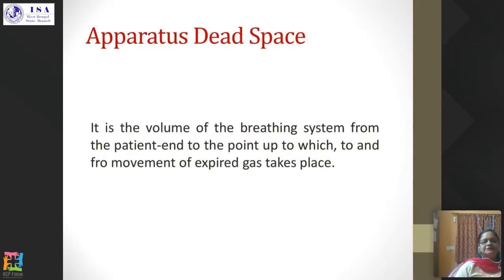Now, what is apparatus dead space? This is very important. It is the volume of the breathing system from the patient end to the point to which to and fro movement of the expired gas takes place. That is, it is the space between the patient end of the circuit up to which the to and fro movement of the expired gas takes place.